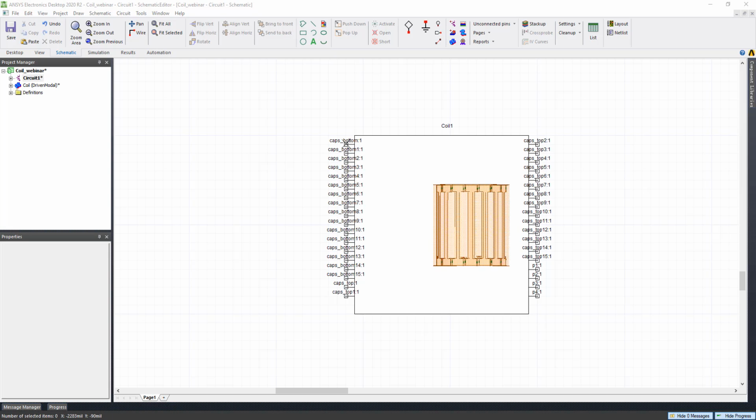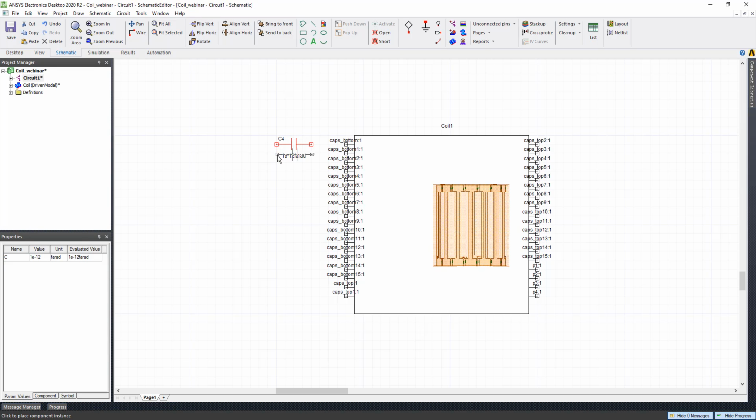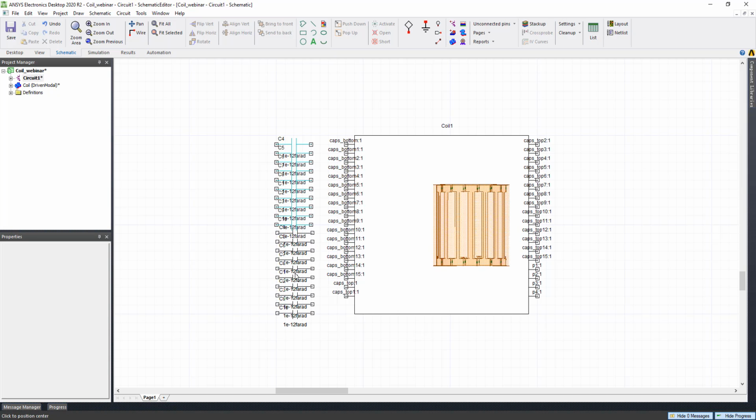Next I'm just going to add some capacitors to it. So I have the capacitors here. I just add the capacitors. Okay, I'm just going to copy a string of it, make my life easier. Okay, maybe it's a bit too many. Just delete two of them here. Looks good. Just copy the string to the other side. Actually, let me change it here first.